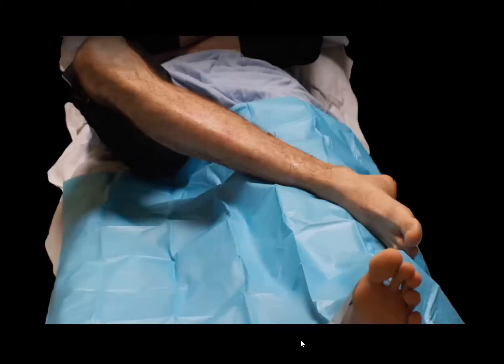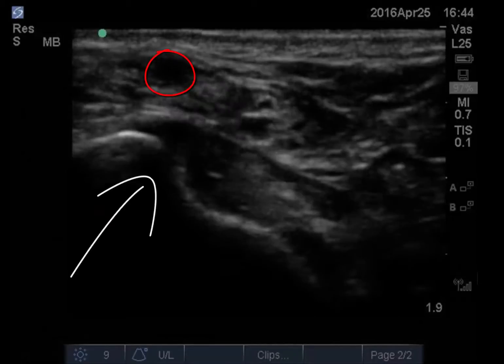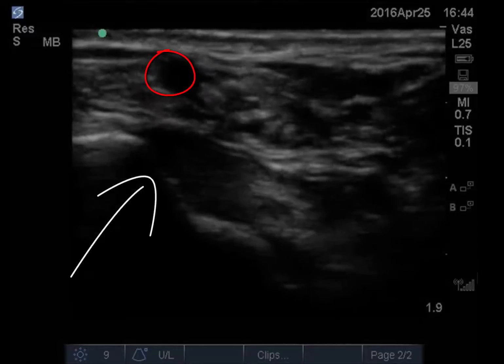Position the patient with the medial malleolus exposed. If possible, resting the leg to be blocked across the other leg in a figure-of-four position allows you good access and maintains patient comfort. When you're ready, place the probe in the transverse plane posterior to the medial malleolus and identify the posterior tibial artery outlined in red.